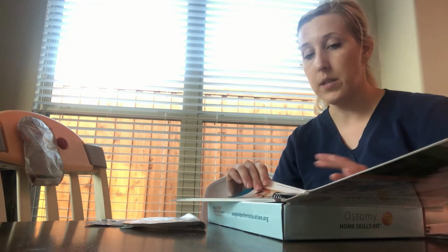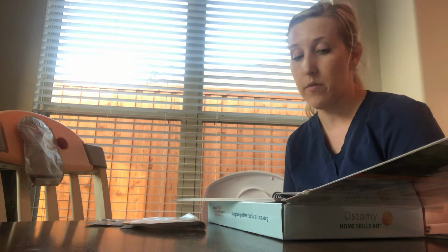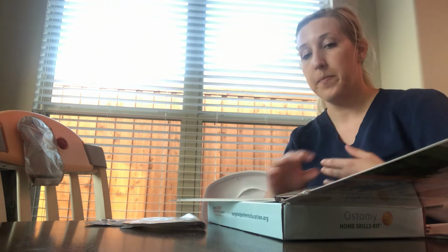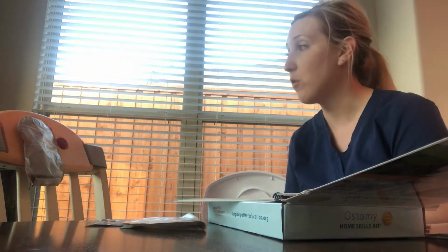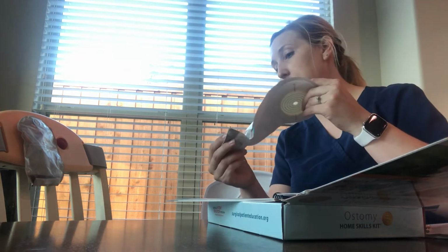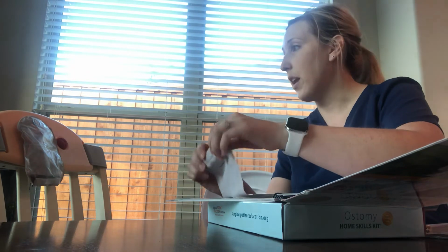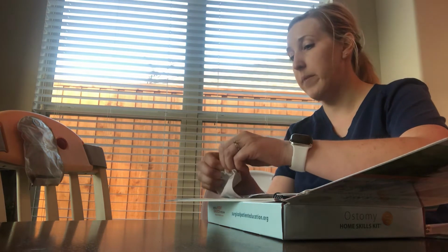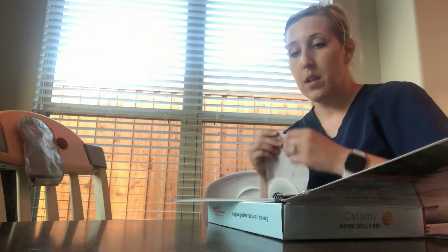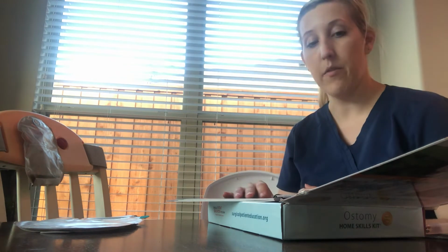It also talks about the different types of pouches that we have available. We have one-piece systems, we have two-piece systems, we also have drainable pouches, and we have closed-ended pouches. With that, we also have different types of pouch closures. So right now, it looks like you are using a clip and roll up, which is what I also have with us. So the clip and roll up, you just roll, roll, roll, and then you Velcro, and then you close. And I'll show you that again when we actually get the bag in place and when we take it to empty it. We also have different types of pouch colors and pouch sizes, so we want to make sure that we get one that's comfortable for you.